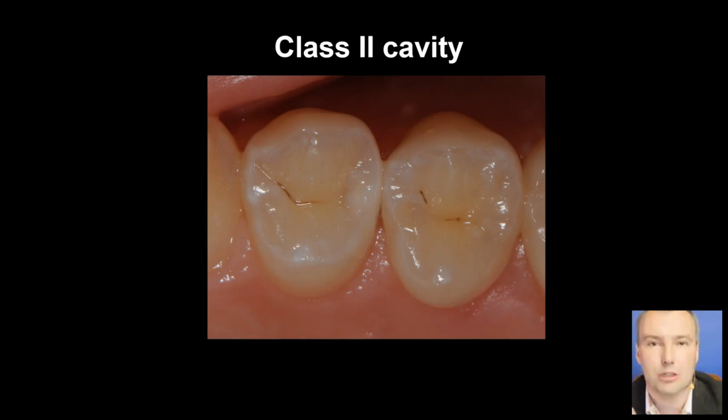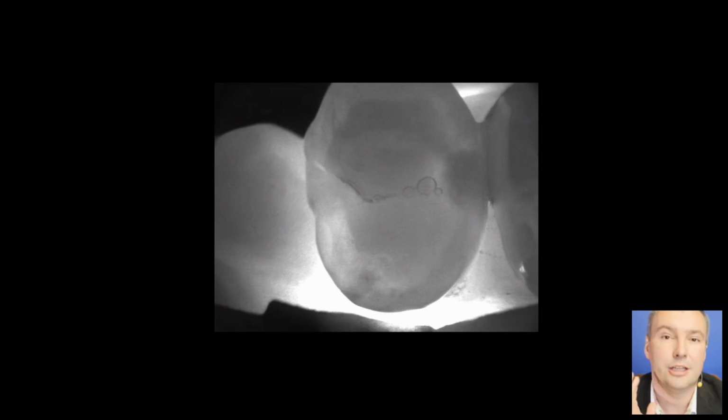So how to work it clinically? This is a typical case for DiagnoCam. Would you suspect something? Maybe you would, seeing the large tooth on the screen, but seeing the small tooth in the patient's mouth, probably you would say it's perfectly healthy. And it was also so for me at the beginning of the work with DiagnoCam. Then we take the transillumination image, we see a large cavity.